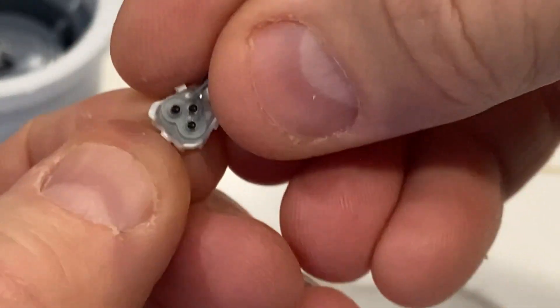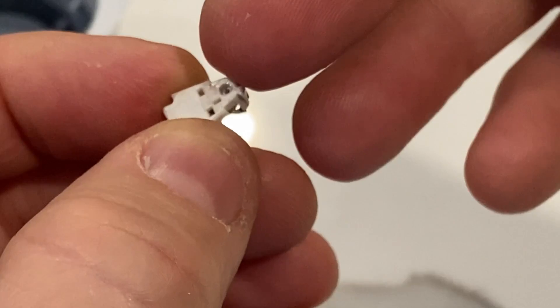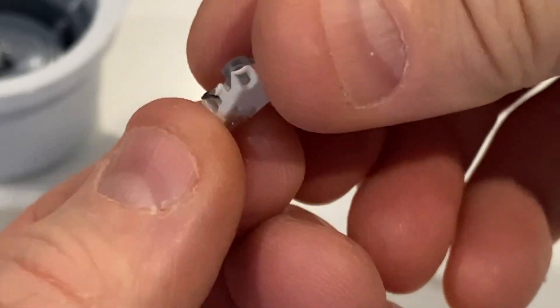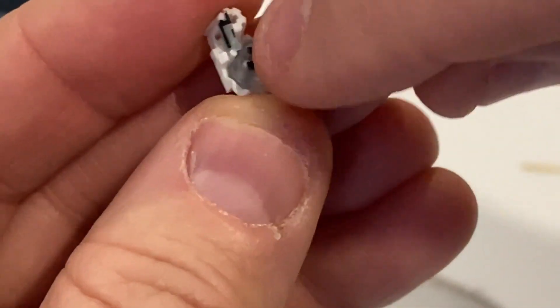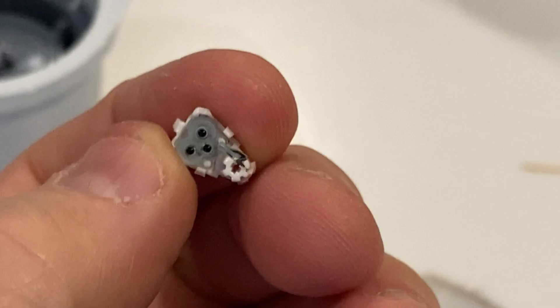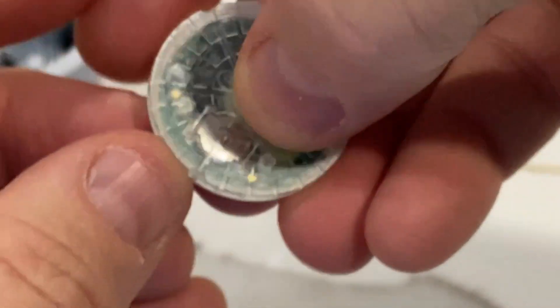Now, how do these work? From what I've read, there's an enzyme that somehow is able to recognize glucose. When it reacts with the glucose, it produces hydrogen peroxide radicals, which I think then in turn react with some metal within the electrodes and produce some kind of a current. So that's basically what's going on. These three contact points here mate with that area there — because it goes flat like this.